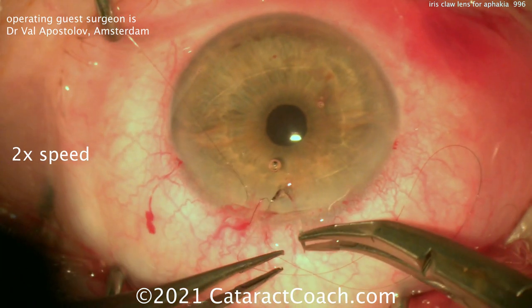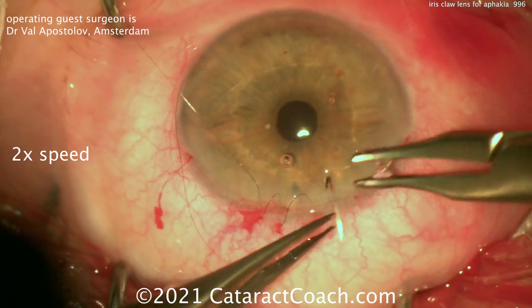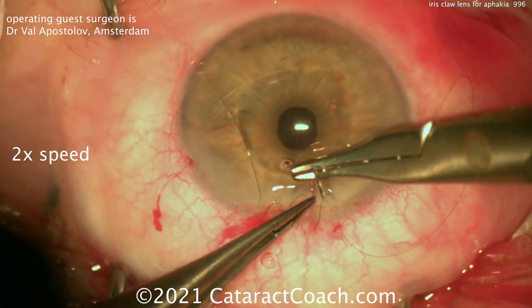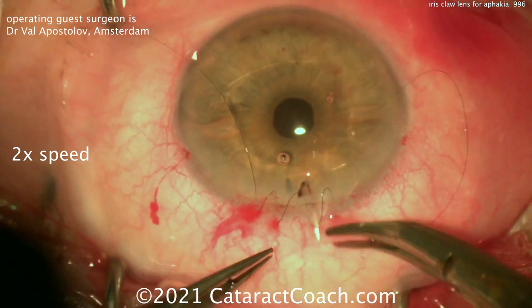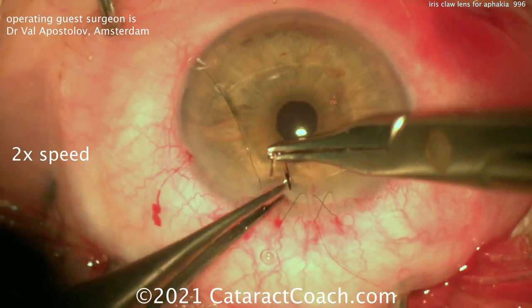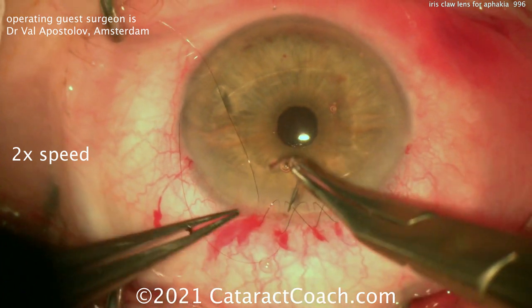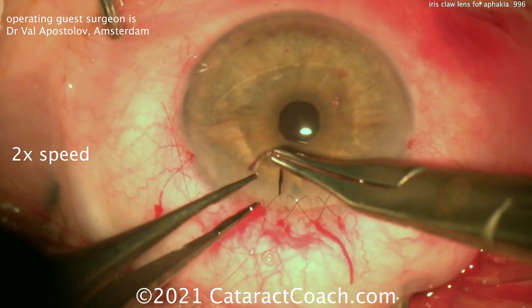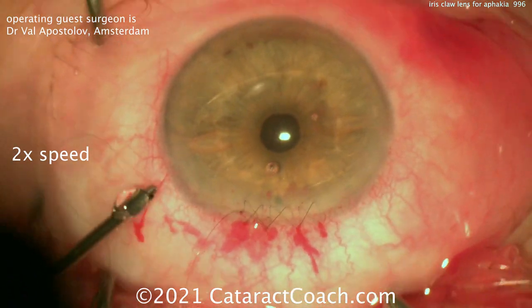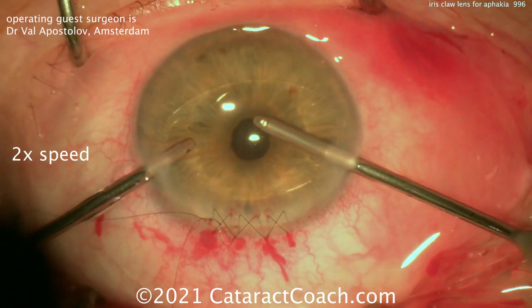This lens is actually not available in the USA. In the USA, we have iris claw lenses for the treatment of high myopia, meant to be placed in phakic patients. Those come in very high negative power, such as minus 12 or 14 diopters. For a routine aphakic patient like this, where the IOL power for the capsular bag would be plus 20 diopters, and this anterior chamber iris claw lens would be more like 18 or 18.5 diopters — we don't have that in the USA. I definitely defer to my international colleagues in Europe and Asia.